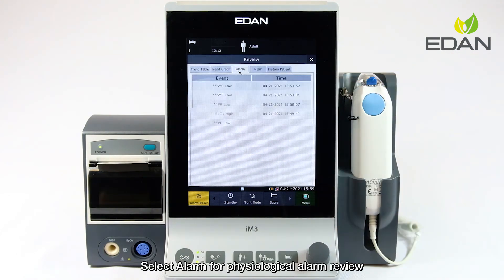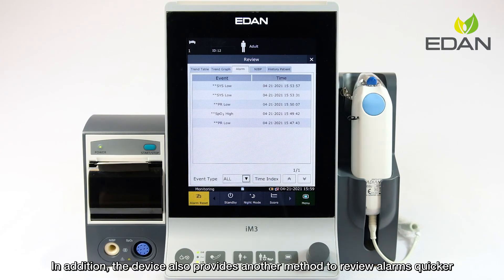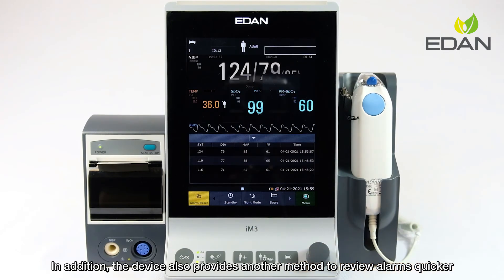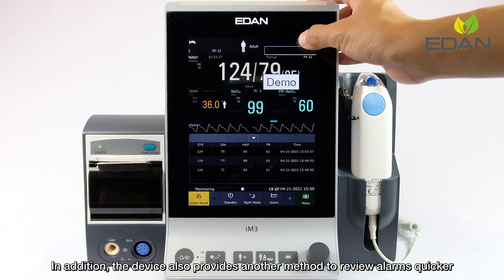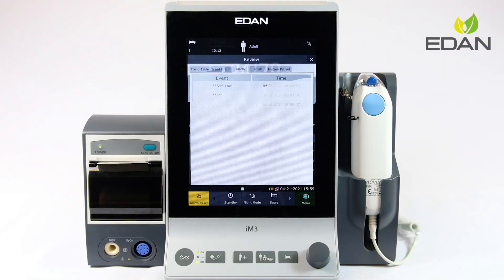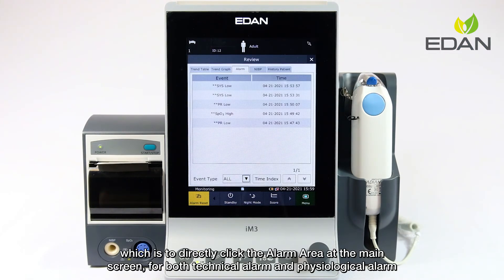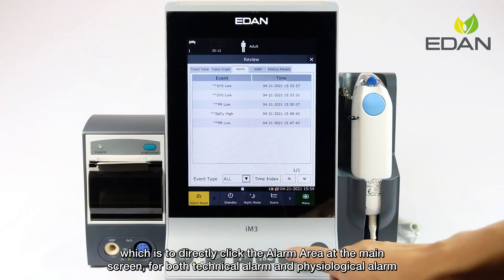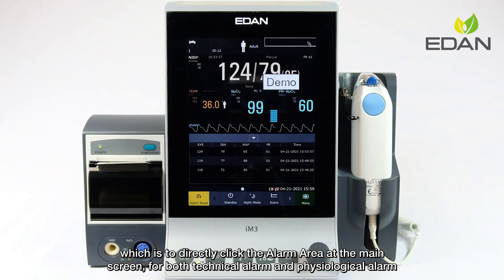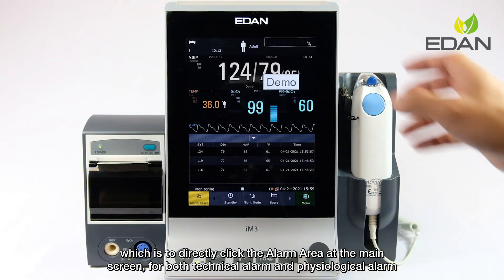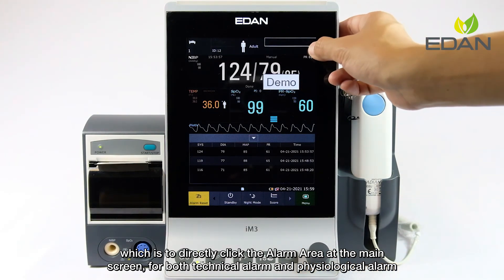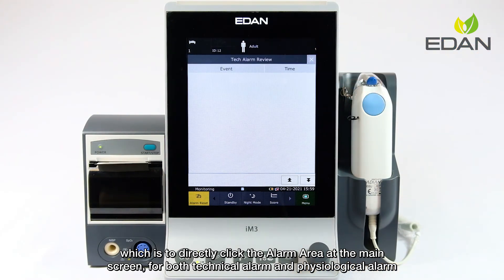Select alarm for physiological alarm review. In addition, the device also provides another method to review alarms more quickly, which is to directly click the alarm area on the main screen, for both technical alarm and physiological alarm.